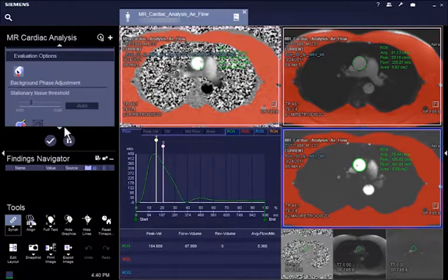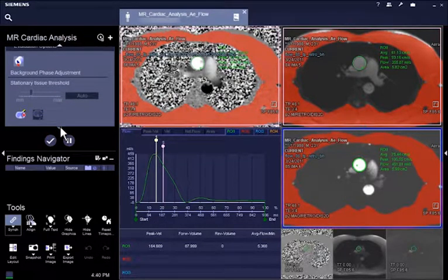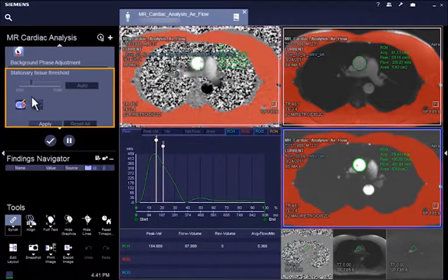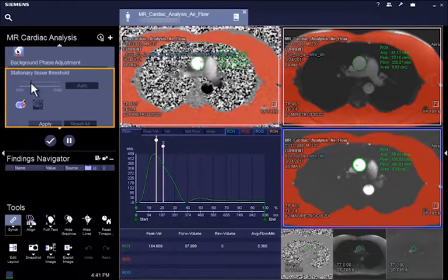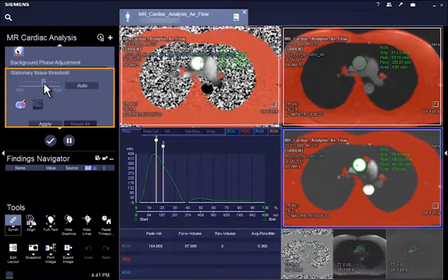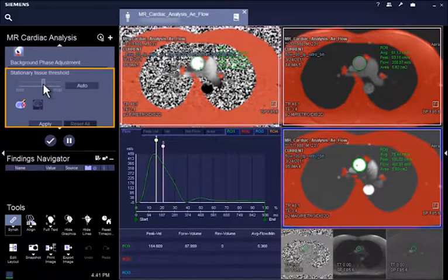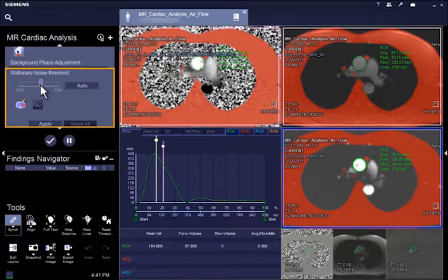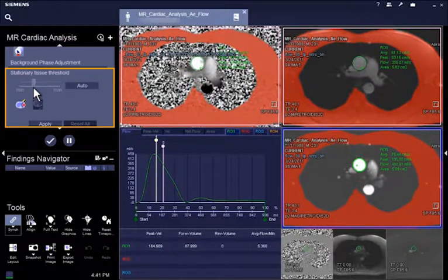In addition, the stationary tissue mask can be defined automatically or manually using the slider. Additionally, user-defined regions can be manually excluded from the stationary tissue mask, for instance in case of aliasing artifacts.